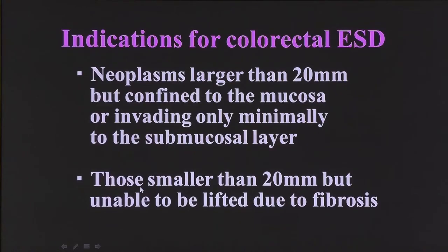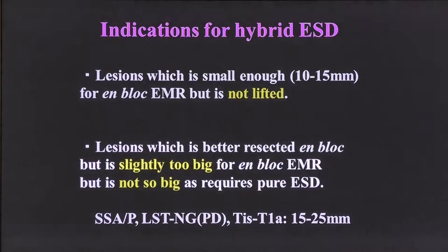Nevertheless, lesions smaller than 20 millimeters but unable to be lifted due to fibrosis are also indicated. And yesterday we discussed hybrid ESD.